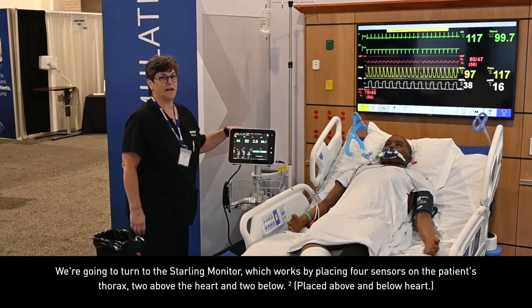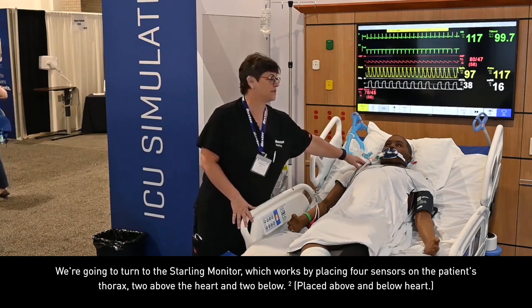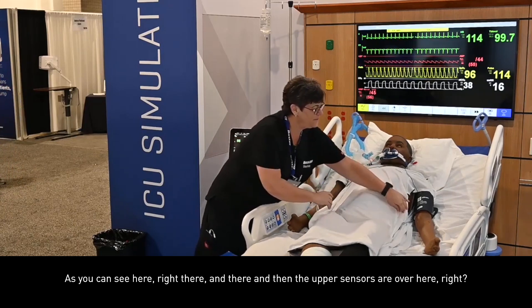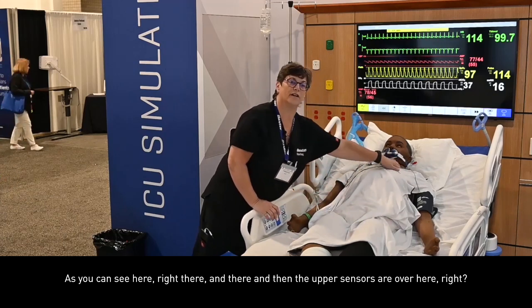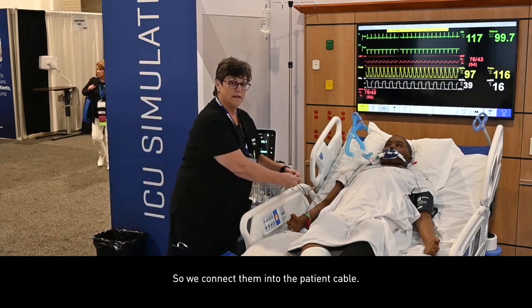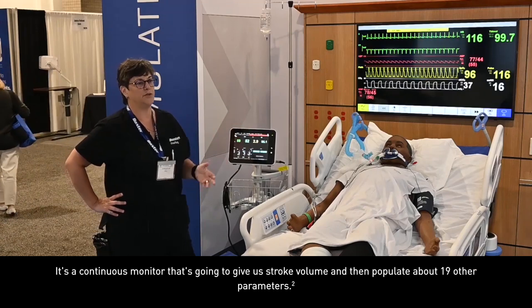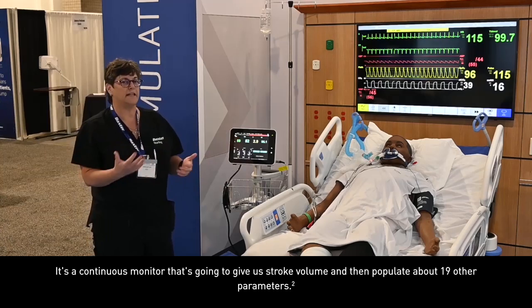We're going to turn to the Starling monitor, which works by placing four sensors on the patient's thorax — two above the heart and two below, as you can see here. There and there, and then the upper sensors are over here. We connect them into the patient cable. We enter the patient's age, height, and weight, and the monitor starts to run. It's a continuous monitor that gives us stroke volume and then populates about 19 other parameters.